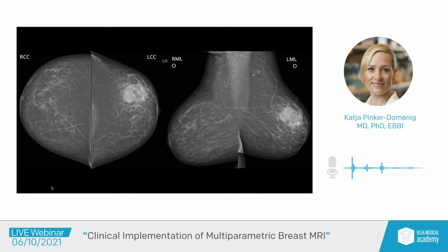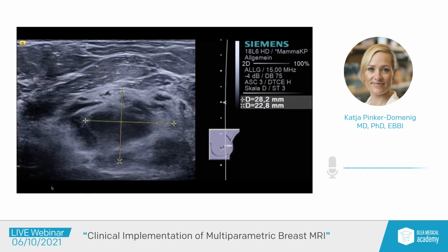So here we have a patient who has a mass, and the story is the patient had a personal history of a vaginal sarcoma, but remote, years back. She shows up with this lesion, which we of course all said is suspicious. This needs a biopsy. The patient was very convinced that as it showed up overnight, it must be a cyst, and we had a long discussion whether we should actually biopsy that. And she was trying to convince me that because there are some hypoechoic areas, this must be a cyst.